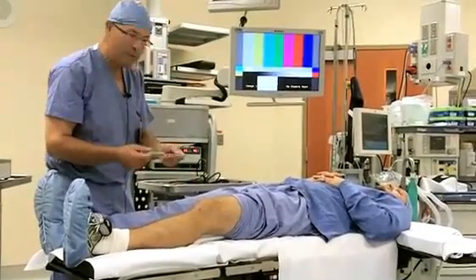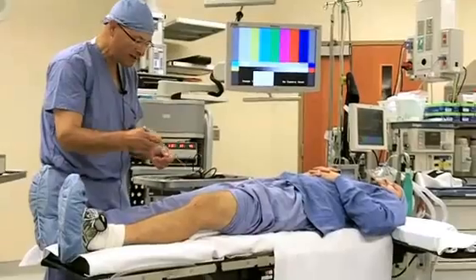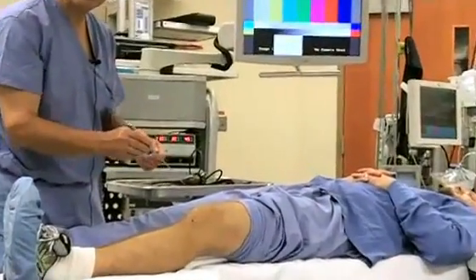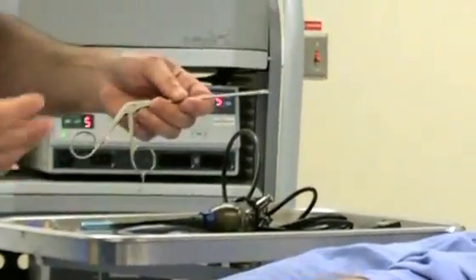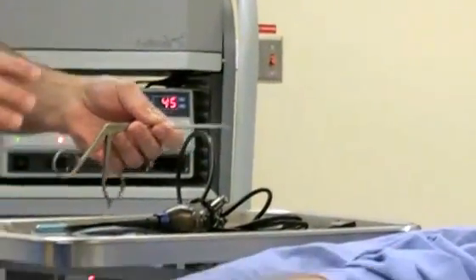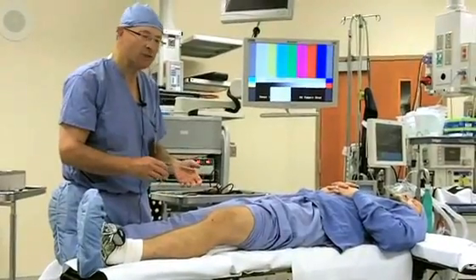The first step in determining how bad the tear is is to use a probe. It's a little hook like a crochet hook. Put it in the knee and pull to see what part of the meniscus may be torn or unstable. Once that's determined you remove in most cases the part that's torn. Some meniscus tears are repaired. In this video today we're going to see a meniscus tear that is not repairable so the part that was torn was removed.